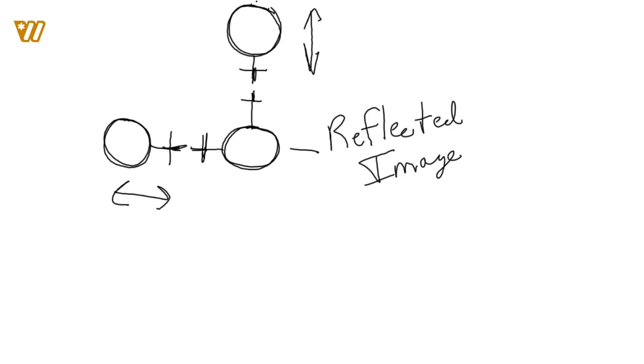Okay? And that's going to be in the text. You guys will see that there on how it works, right there listed for you in text. The key thing to circle there is, remember that it thinks of the cornea as a convex mirror. And what you do is the second line, you measure the size of the reflected image. Very good.